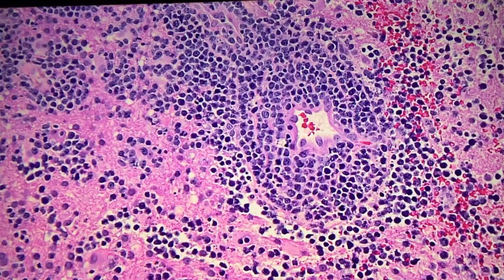And when you look at it, you can tell right away this is something malignant because it's high-grade. So lymphomas in the brain are generally diffuse large B-cell lymphomas. They're high-grade lymphomas. If you can see this perivascular packing of these cells around the vessels, that's pretty characteristic and should make you think of lymphoma.